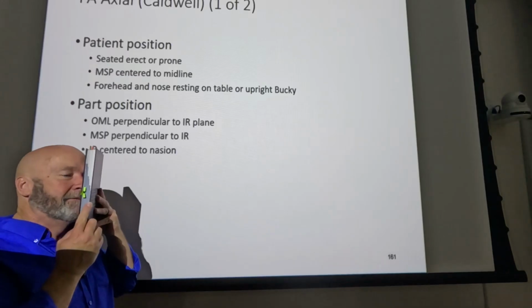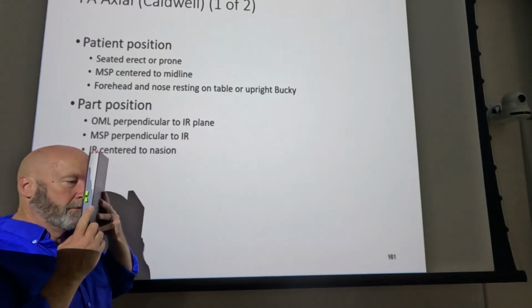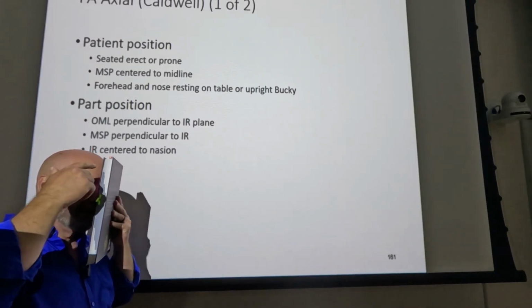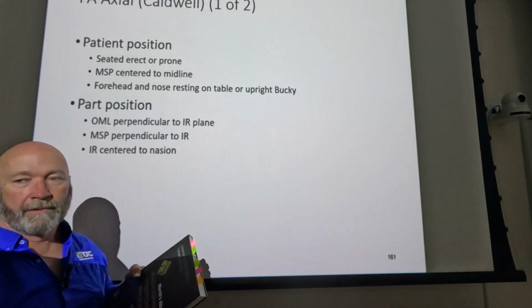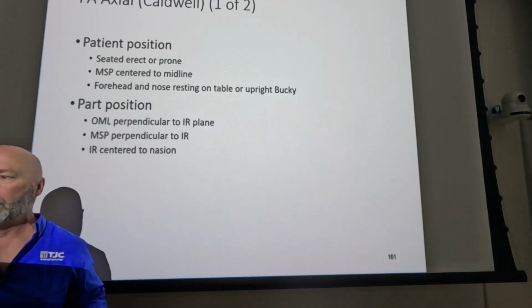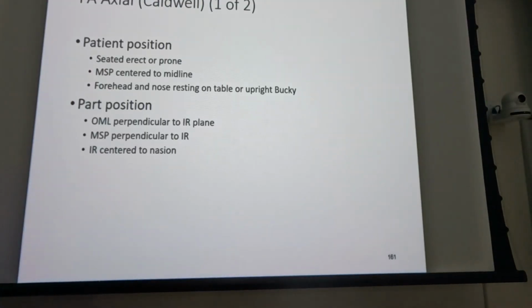go with the forehead, cheek, and nose, what's going to happen is that's going to elevate the optic canal, and it's going to put it into the bones, and you're just not going to see it at all. So the view that you're trying to use to visualize the optic canal is not going to visualize the optic canal at all. So the thing that probably should go away has gone away and off the registry, since you're going to position wrong and not get it right anyway.